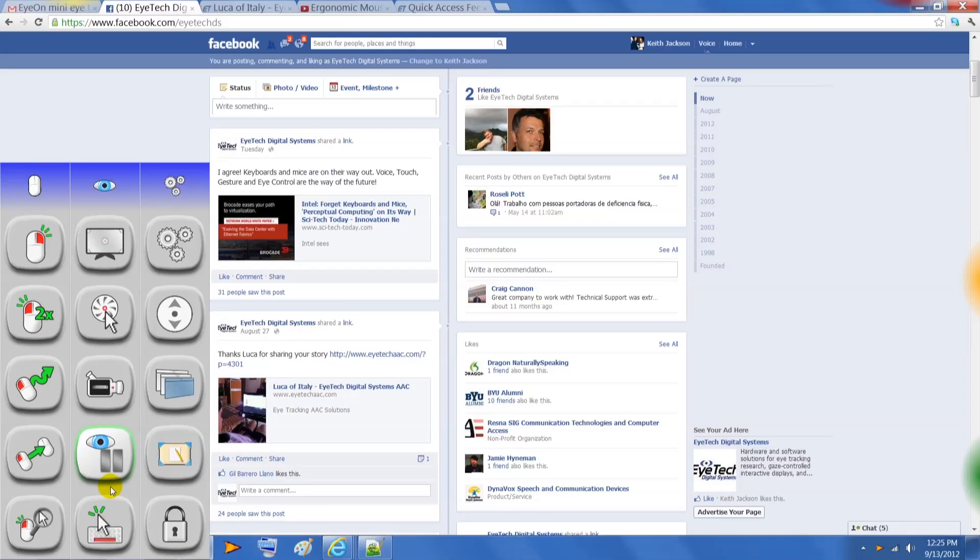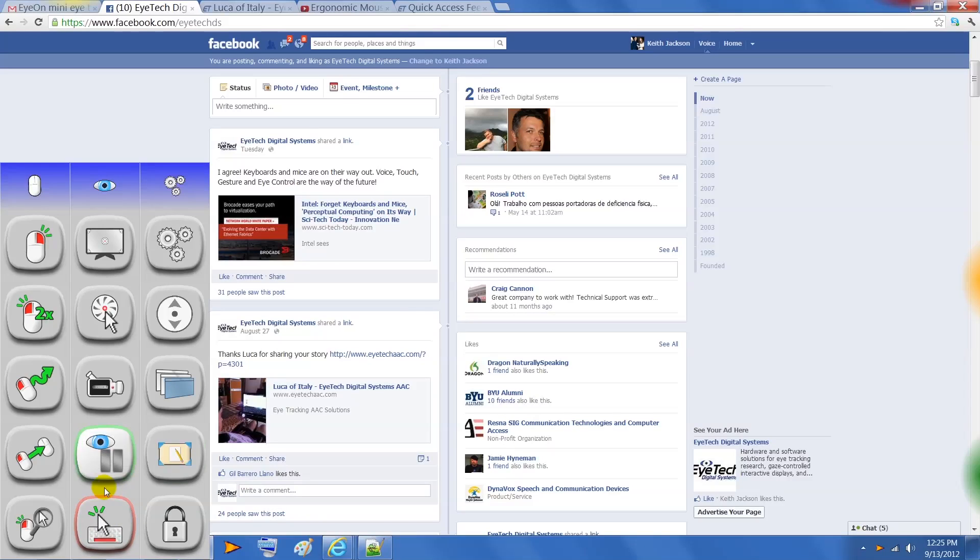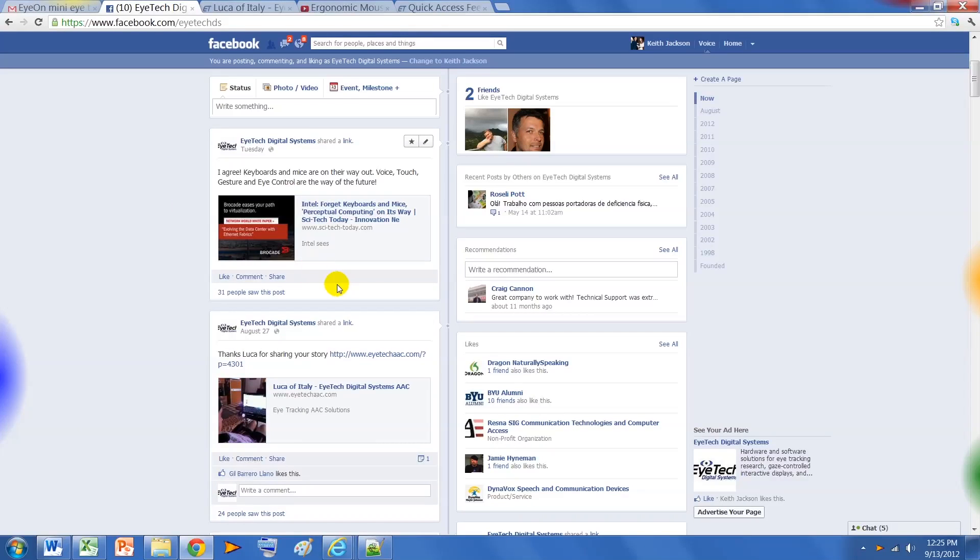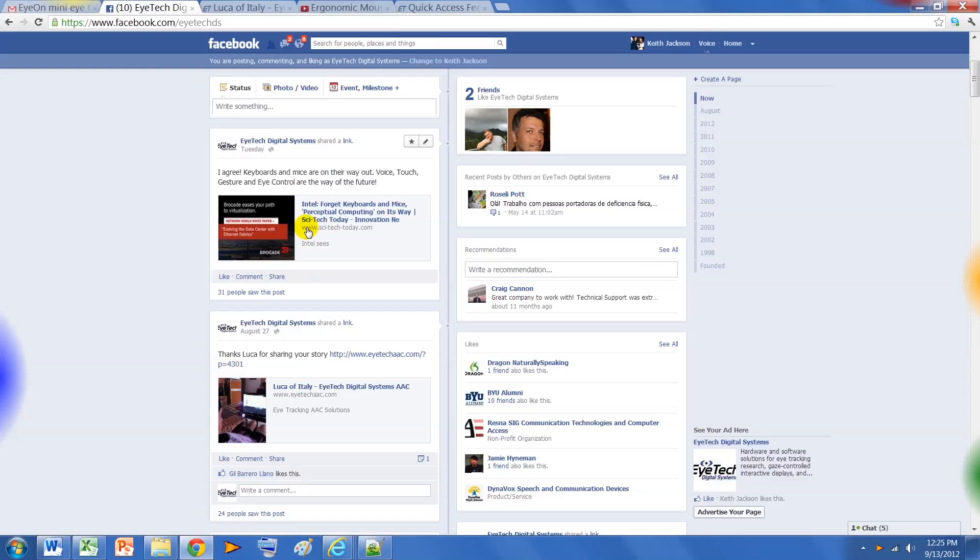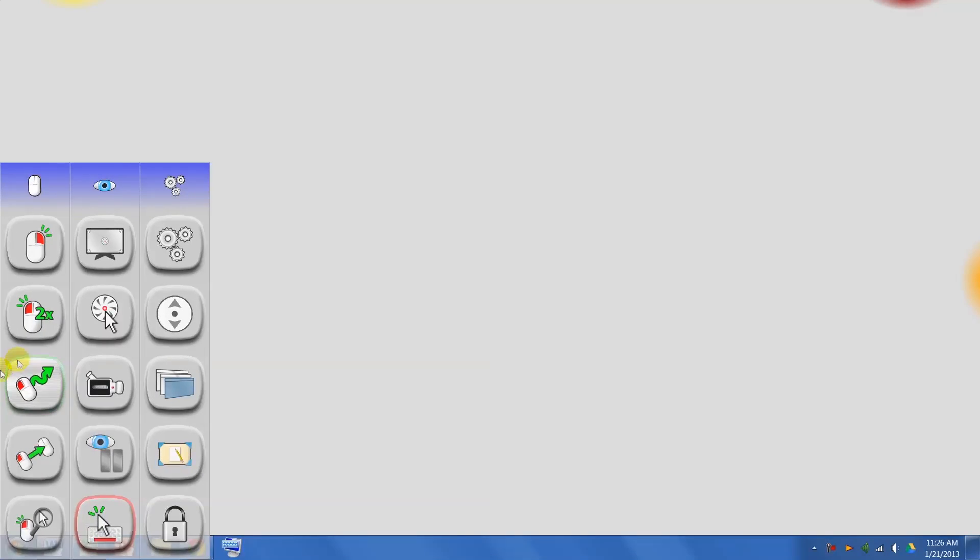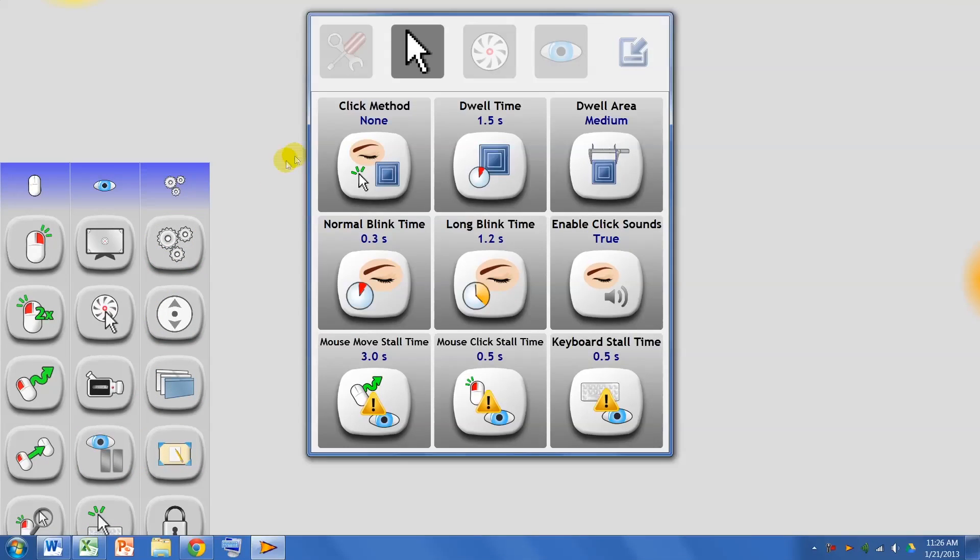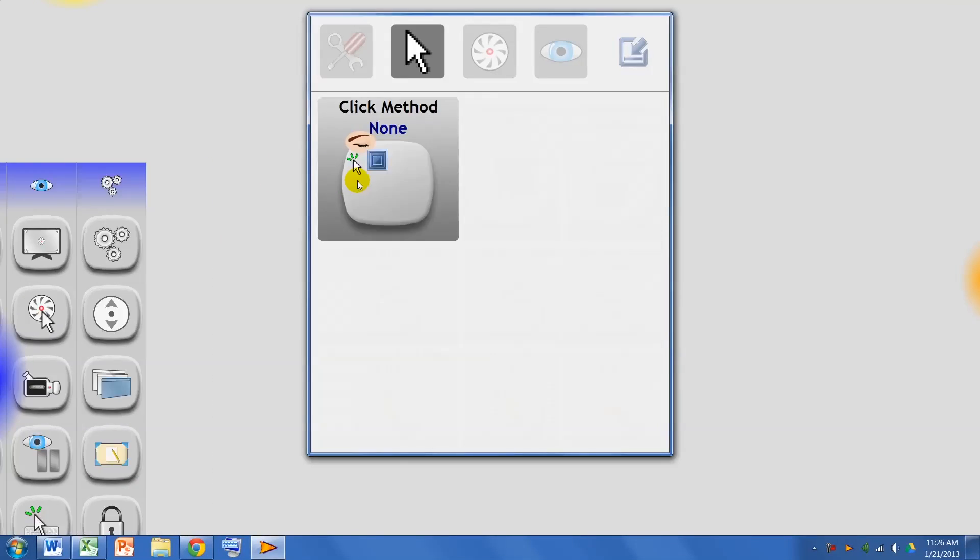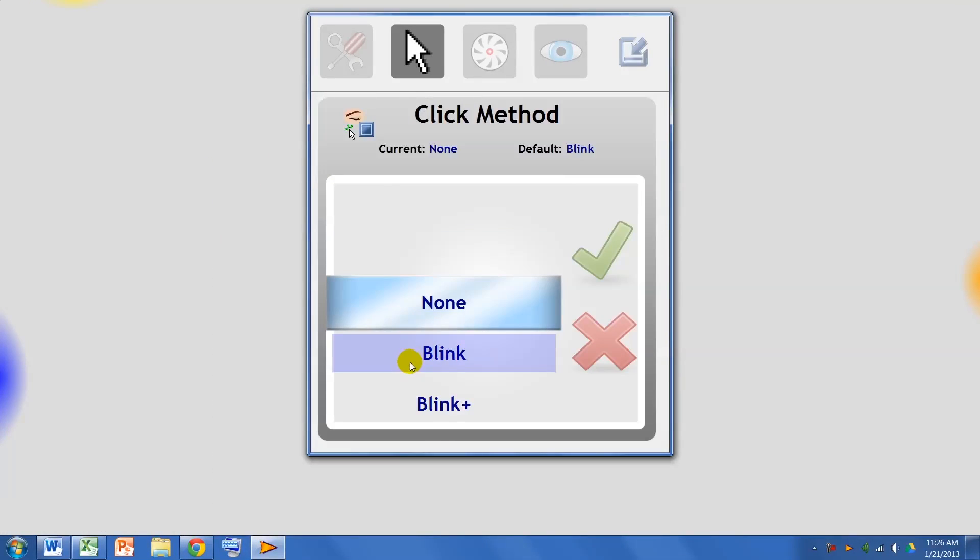For those using their eye tracking mouse in tandem with their keyboard, can now use their space bar to click. It has built-in intelligence to not do a click while you are typing. Remember that blink click is the default, so when you select this space bar for clicking, you can now do both. If you want to disable blink click, and only use space bar for click, then visit the mouse click settings to adjust to your needs.